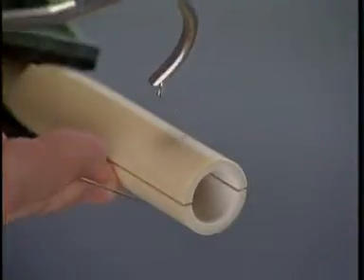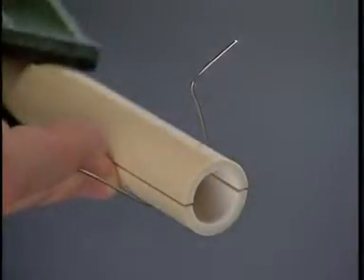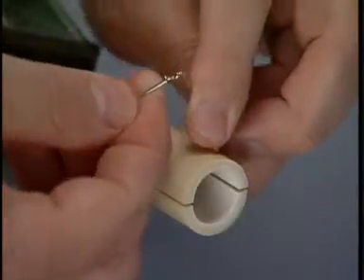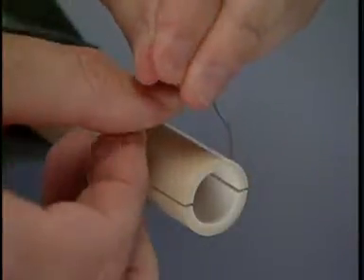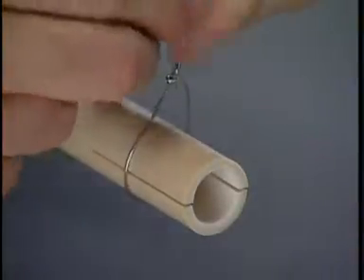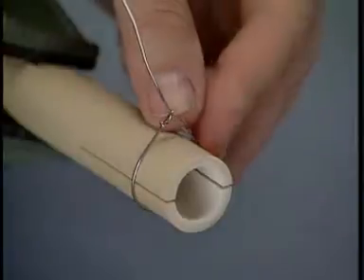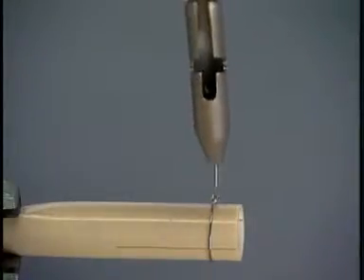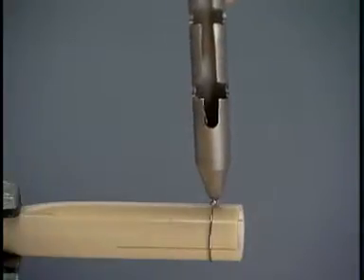Withdraw the wire passer and remove it from the wire. Insert the straight end of the wire through the eye.